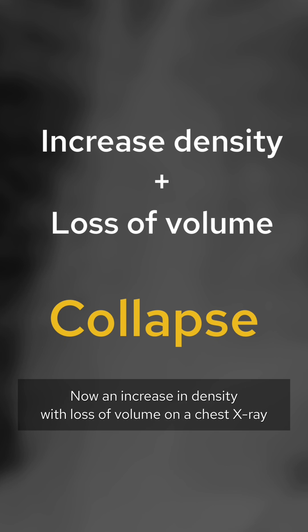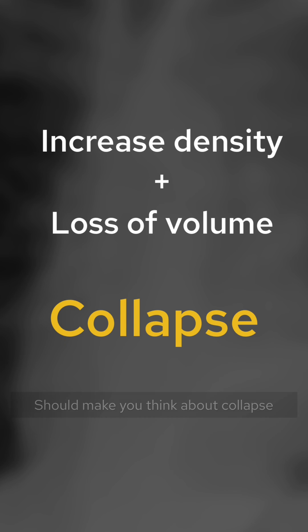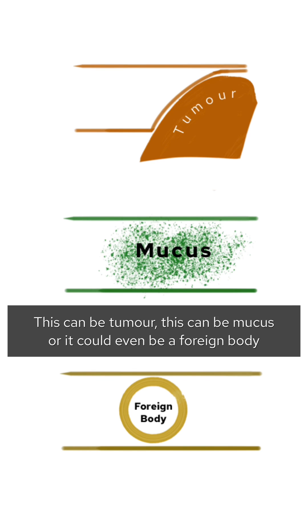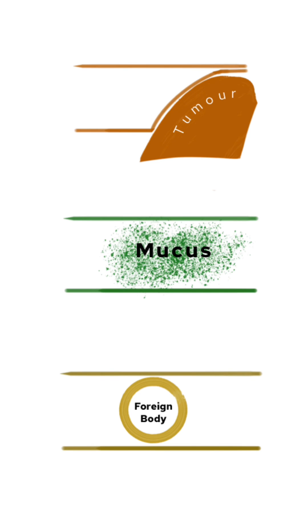An increase in density with loss of volume on a chest x-ray should make you think about collapse. Collapse happens when there's something blocking the airway — this can be tumour, it can be mucus, or it could even be a foreign body.